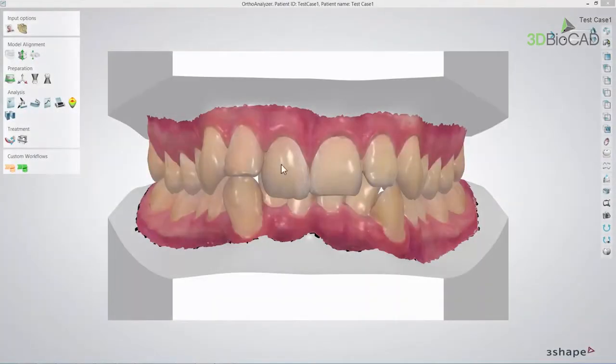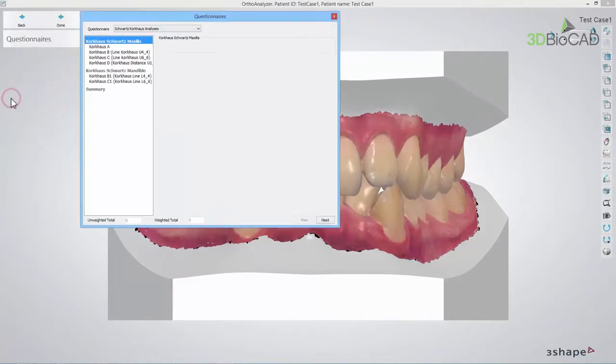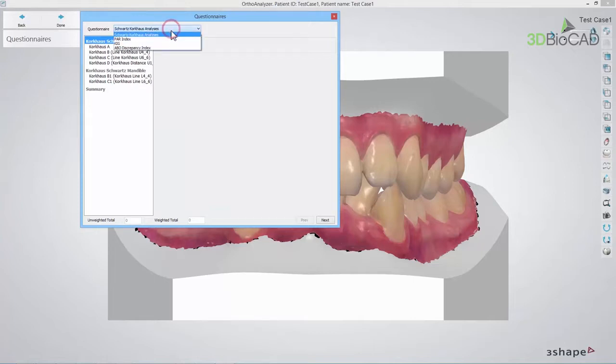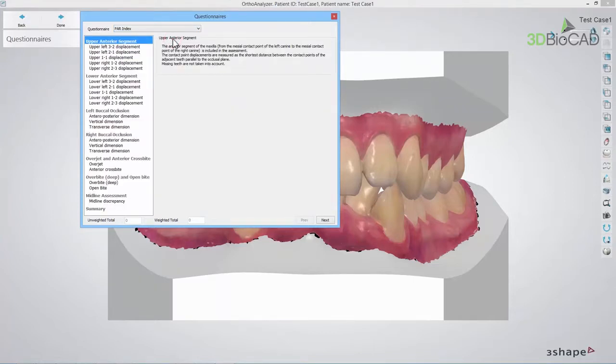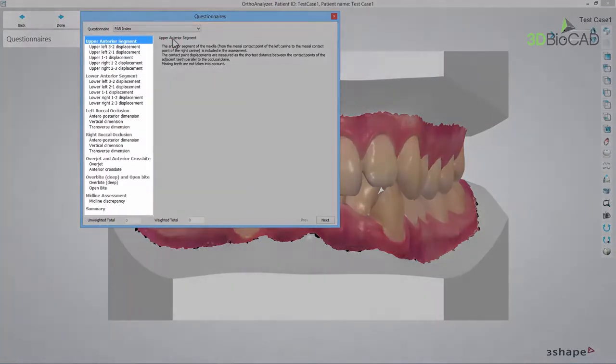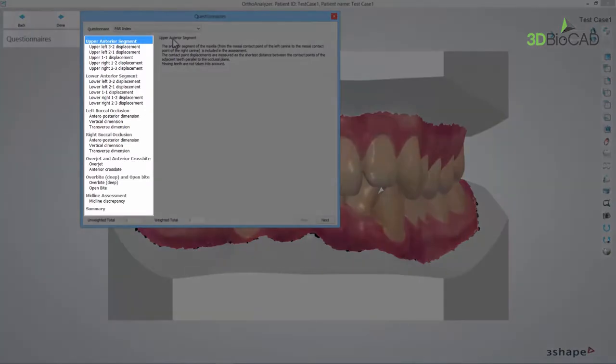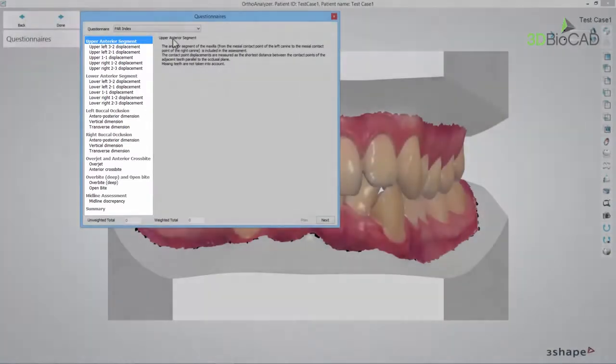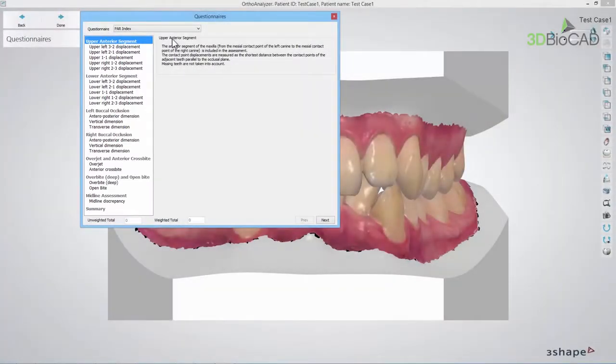Once in OrthoAnalyser, select Questionnaire from the Analysis section. In the pop-up window, select the PARIndex option from the drop-down list. You will notice that the scoring system steps appear on the left and you are able to click the specific step to go to it.